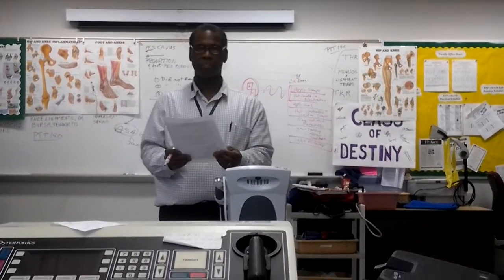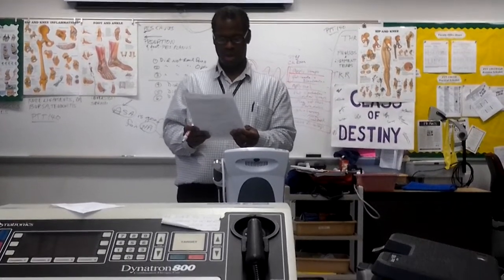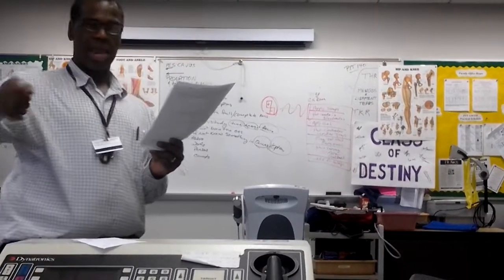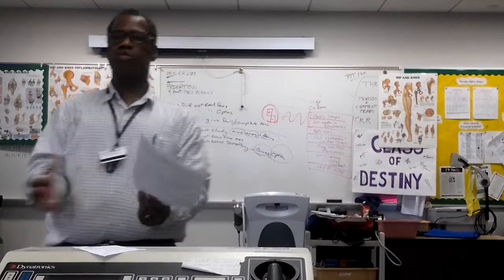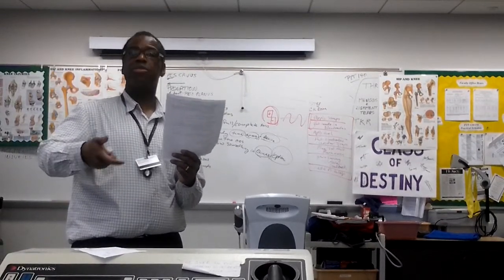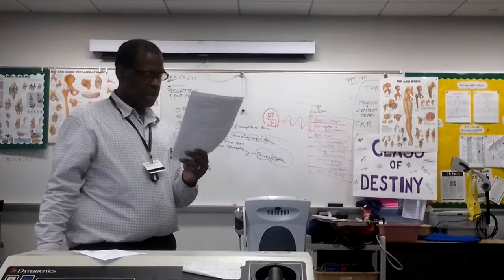Polarity. What does polarity mean? Either negative or positive. All right, so if I'm doing a monophasic machine and I change it to negative, what am I doing to the treatment? I'm killing bacteria. But if I change it, I'm doing what? Healing. I'm doing healing, just with a button. Just with a button, okay?